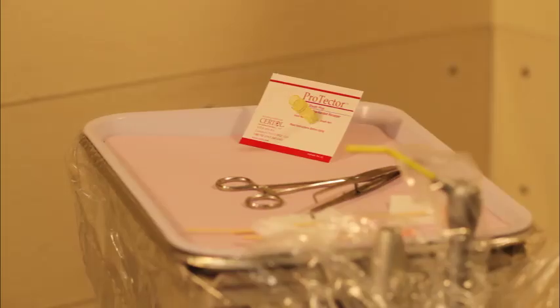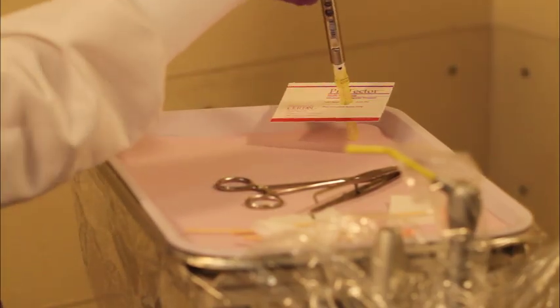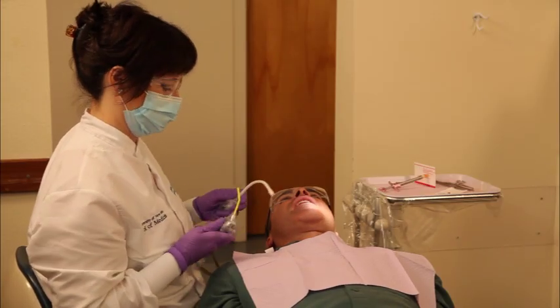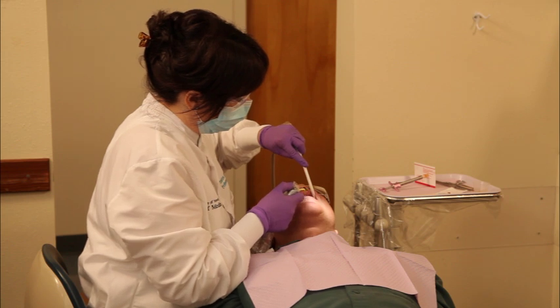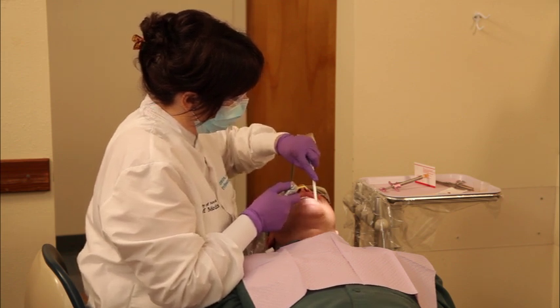Carefully withdraw the syringe and immediately recap the needle using the one-handed scoop method with a needle sheath prop or other recapping device. Rinse the patient's mouth and wait until anesthesia takes effect before beginning treatment, approximately 3 to 5 minutes if administered with the inferior alveolar block or 1 minute if administered alone.